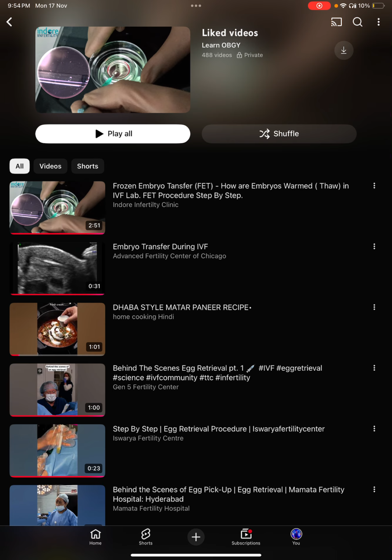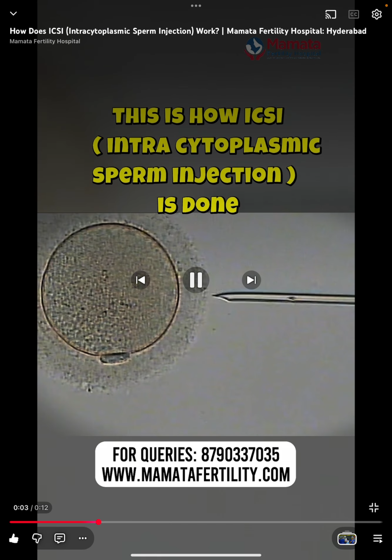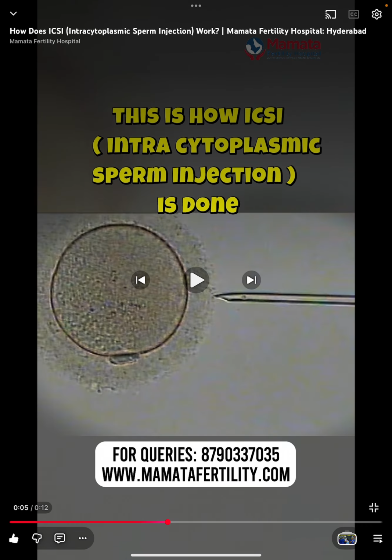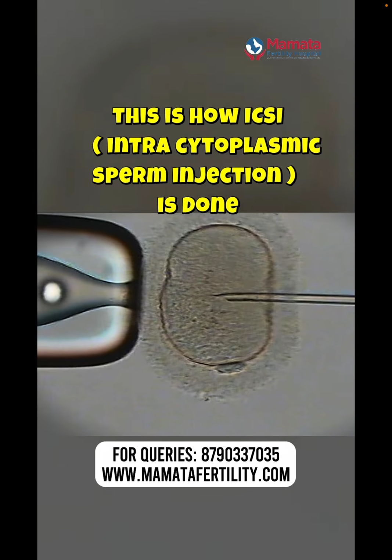So ICSI. If you see, this side needle is the injecting needle, the injecting pipette, and this is the total oocyte, and there is a polar body which you can see. This injecting needle is being injected at the 3 o'clock position. You see the sperm is being injected into the cytoplasm, and on the left side there is a fixed pipette that is known as the holding pipette. This is the injecting pipette and this is the holding pipette. The holding pipette is fixing the oocyte.